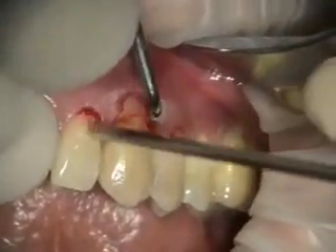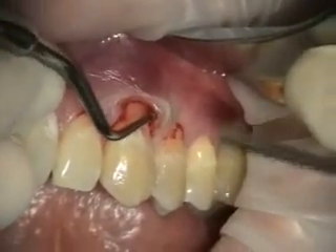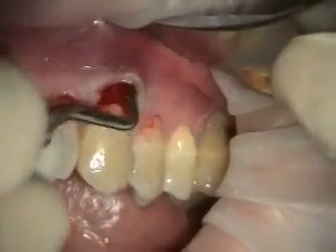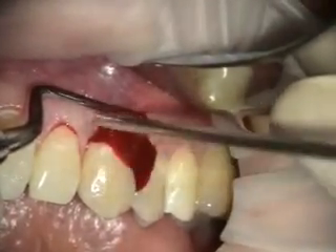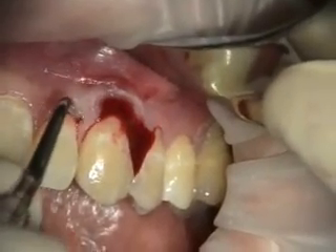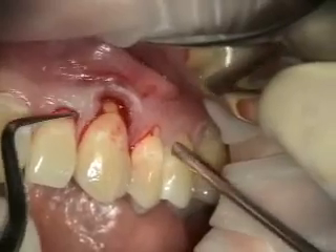We're using a little endosurgery spoon — it's got a little straighter angle. It's cool, it's nice.